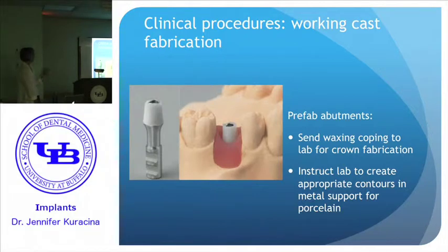Now, the waxing coping that comes in that all-in-one kit has to go to the lab. If you don't send it to the lab, the lab has to order them, and then when the lab orders them, we have to pay for it, versus when Deb orders them through the school, we don't pay for them. So use the ones that we get for free instead of having us pay for new ones. So these kind of become the foundation for the crown that's cast.